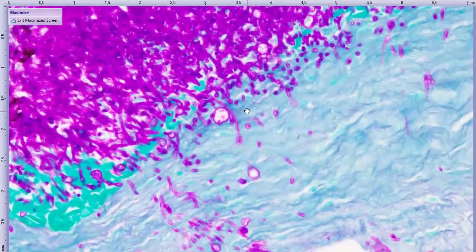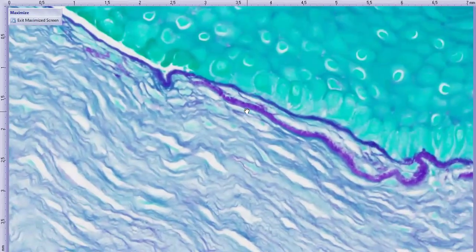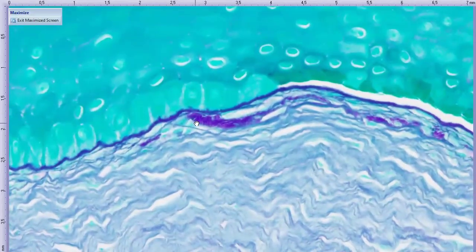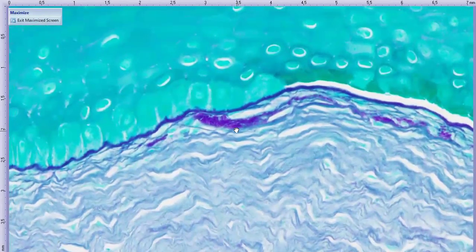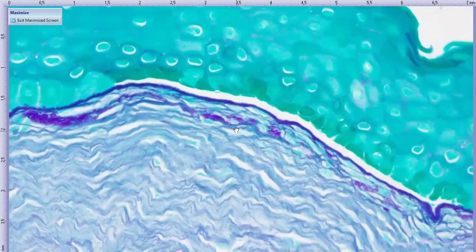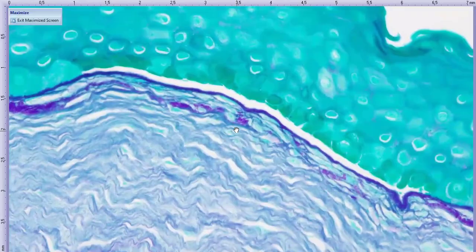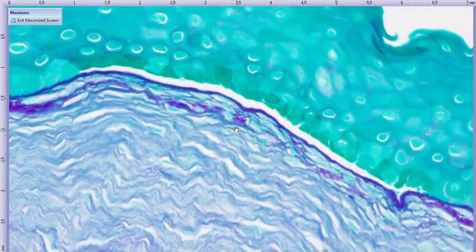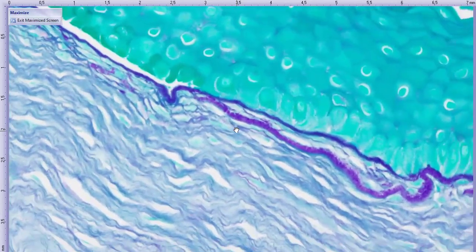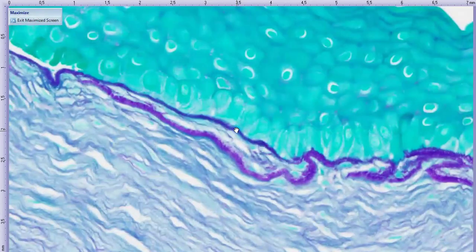Actually, go to the right again. Up, under the epithelium. Go to the left now. That interesting PAS positive stuff is probably irregular basement membrane, which I think would be considered what Dr. D said is a hallmark feature of previous ulceration, but definitely an abnormal basement membrane. You can see where it's separated from the basal layer there. So kind of interesting.